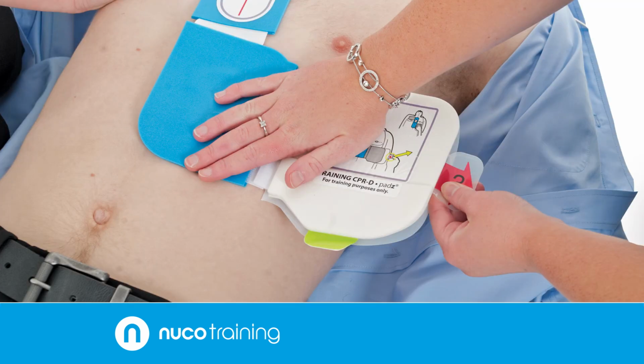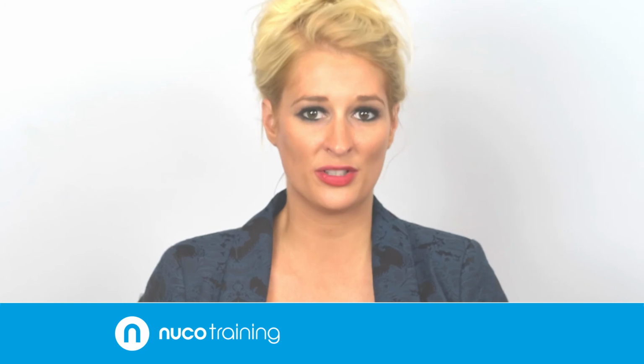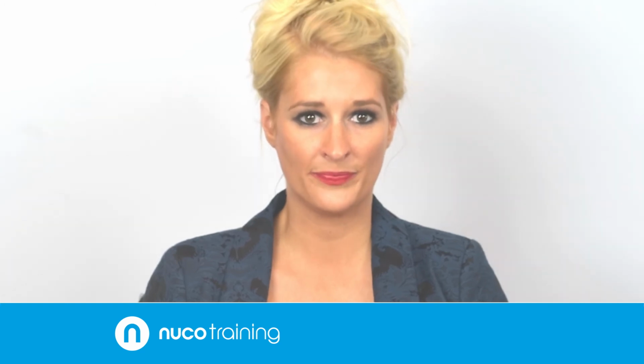In the past, defibrillation was only ever offered by professional medical personnel. Over recent years, this has changed with the development of AEDs. This means that with some basic training, we can all use it, because it is automated. The chain of survival. It is critical that you follow the chain of survival when you're dealing with a casualty who is not breathing normally.